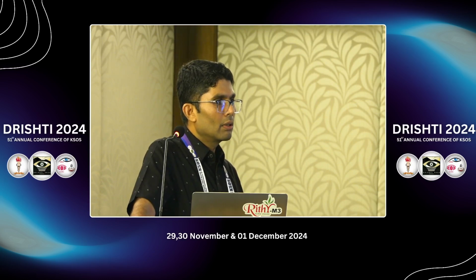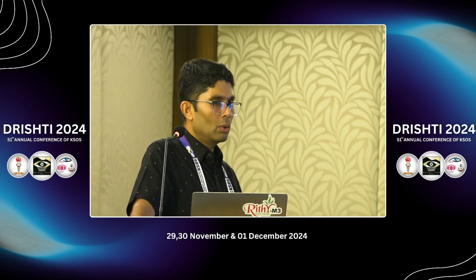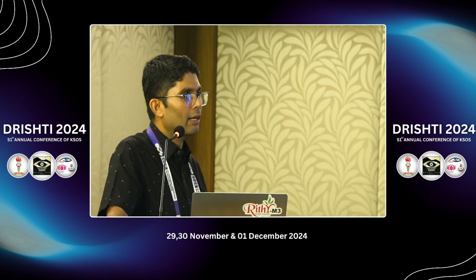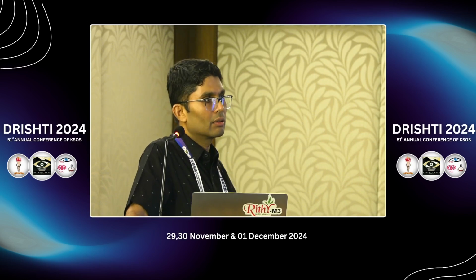In a VMT case, can we just do away with the tamponade? Yeah, we could just do an air fill. I usually prefer a tamponade, at least air. I fill in with a fluid air exchange at the end of the procedure rather than a saline fill.